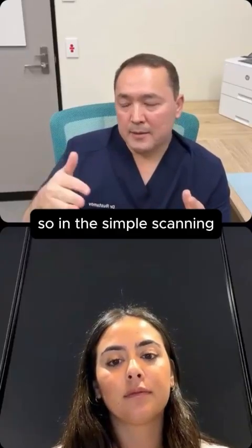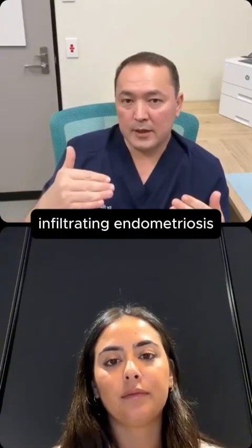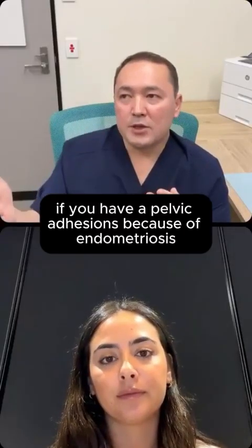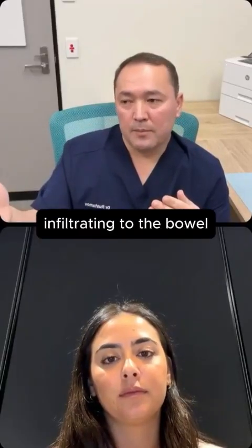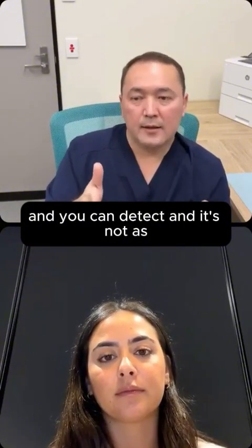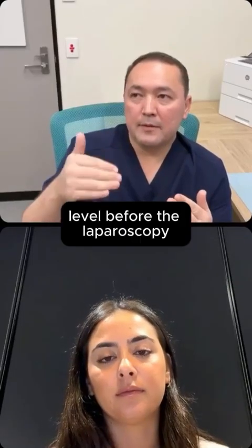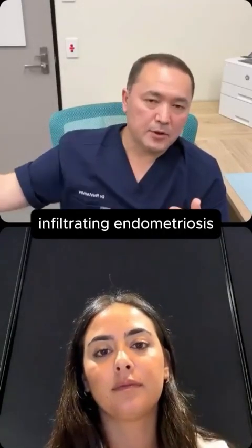In simple gynecological scanning or fertility scanning, you may not be able to diagnose deep infiltrating endometriosis, but in deep pelvic scanning, it can be diagnosed. There are certain features, for example, if you have pelvic adhesions because of endometriosis, or endometriotic nodules infiltrating the bowel, bladder or uterus, in deep pelvic scanning you can detect them. It's not as sensitive a diagnostic as laparoscopy, but before doing laparoscopy, you can do deep pelvic scanning to rule out deep infiltrating endometriosis.